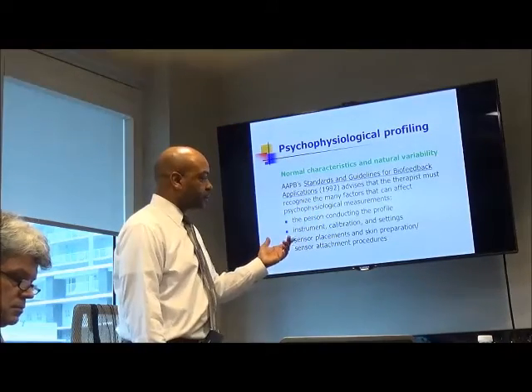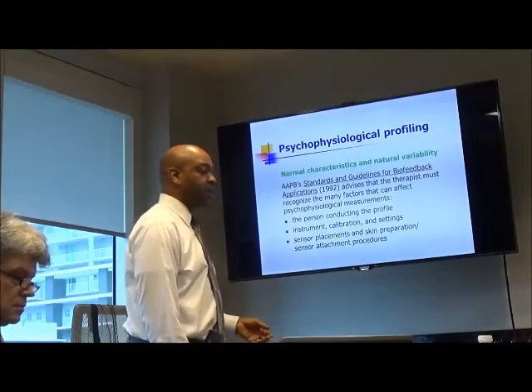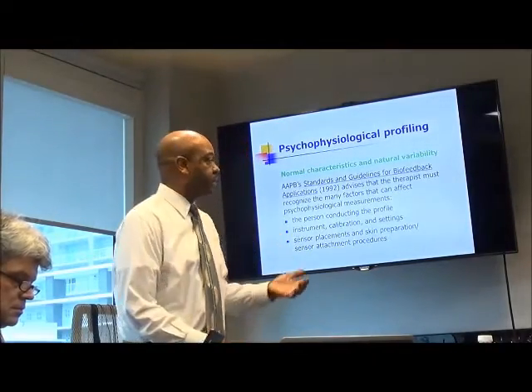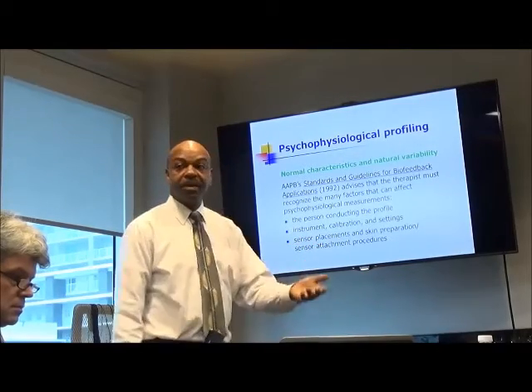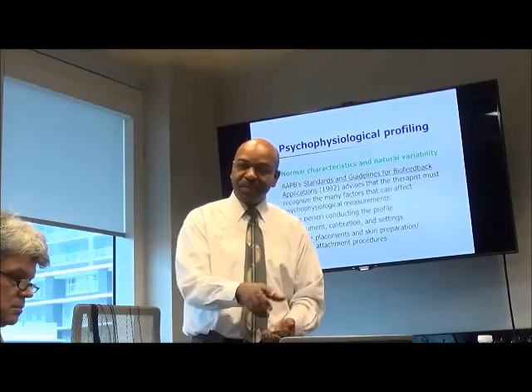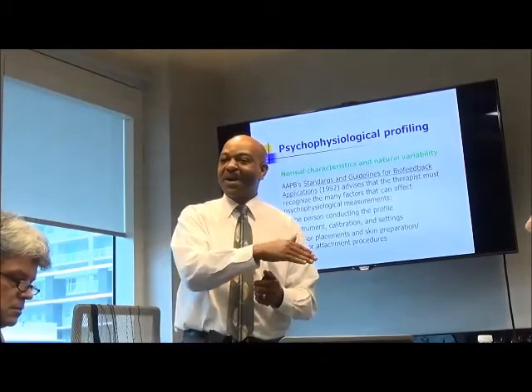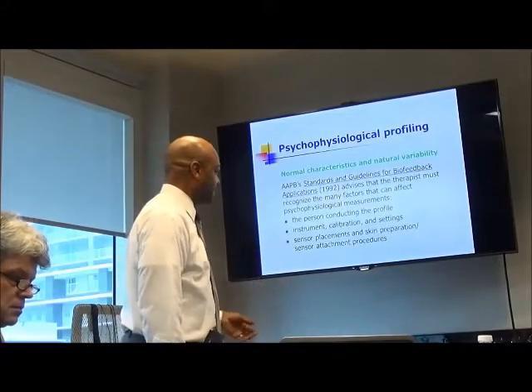The instrument, making sure that it's calibrated properly, making sure that it's set properly. Things like the filters, you want to make sure you know, do I intend to use a narrow filter or a wide filter? Is my system calibrated? It's like you're going to weigh yourself because you want to lose weight and you forget to zero the scale, and you get on and you think, oh great, I'm losing weight, but it was off and it was 3 pounds below zero, so you didn't make any progress. You just need to set the scale properly.